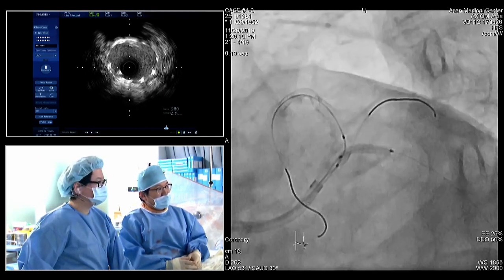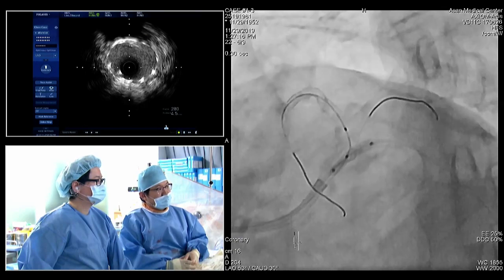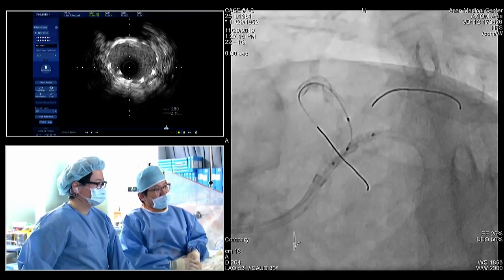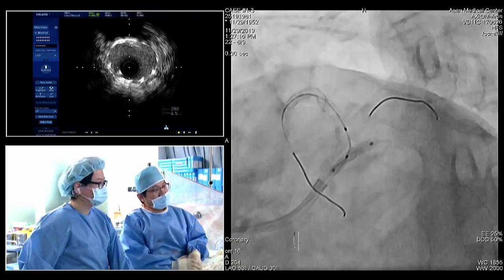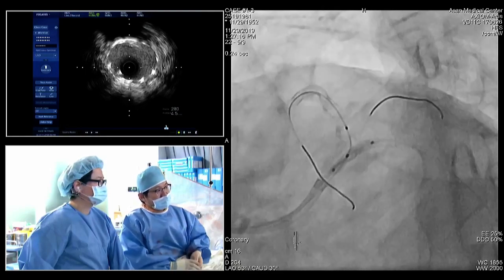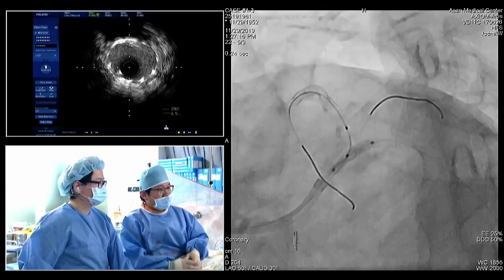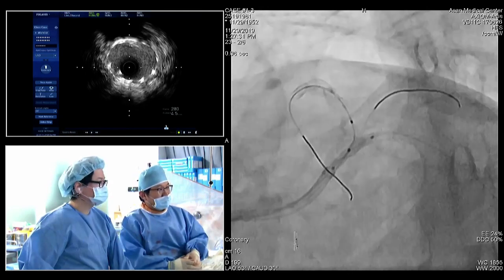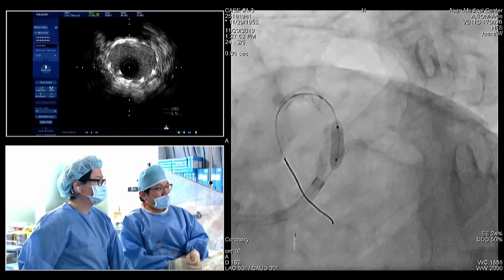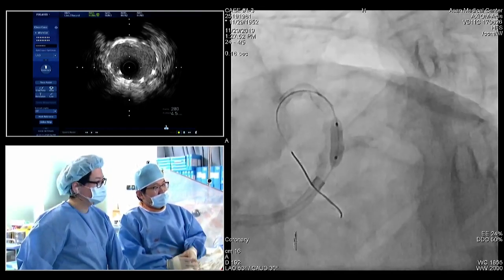Next. I implanted a short stent, 12 millimeters, 2.5. Next. Before removal of the circumflex system, I applied 2.5 high pressure inside the stent to maximize the circumflex ostium stent cross-sectional area before crush. Next. And then using the 3.5 high pressure balloon, I crushed the circumflex stent.